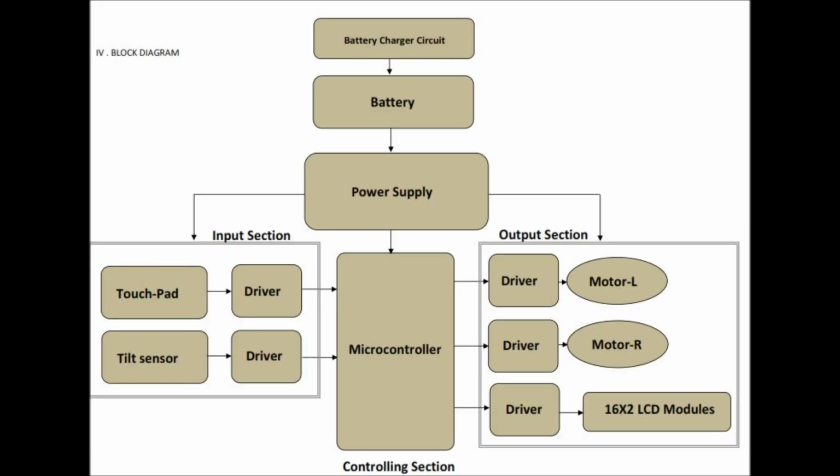Hi, I'm Raghuchandra. I'm here to explain the block diagram. So we have different blocks here. The first block I'm taking is the motors, left and right. We have used high-torque PMDC type side shaft motors of 24 volts and 8 amps current, which carry a human weight easily. We have programmed these motors to run at 20 kHz working frequency by using the PWM technique.